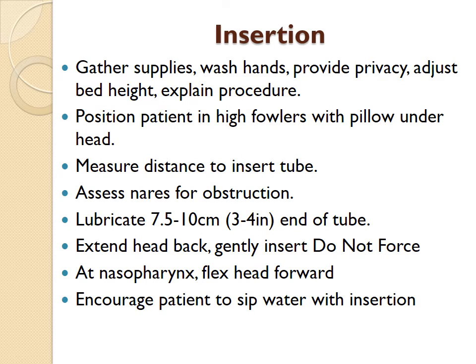Now, once you have gathered all of your supplies, make sure that you wash your hands. You've heard me say enough times, the first thing you do before any skill is to wash your hands. When you get into the patient's room, you make sure that you identify your patient using your two identifiers, name and date of birth. You want to provide privacy, adjust the bed height for your comfort.